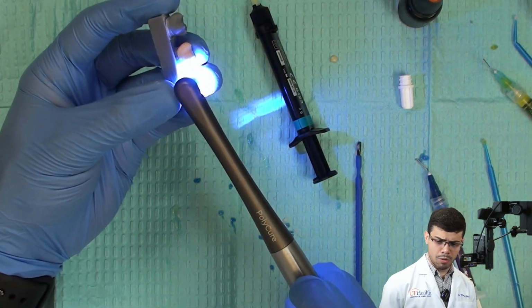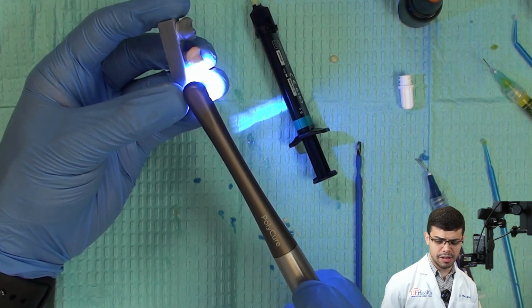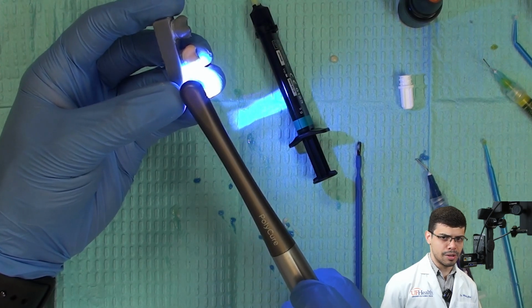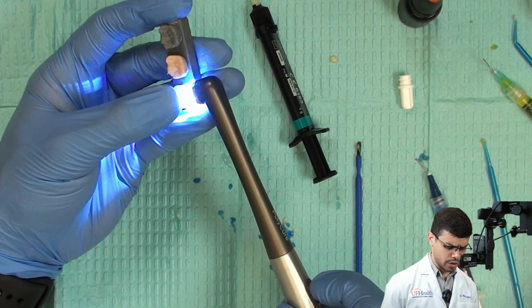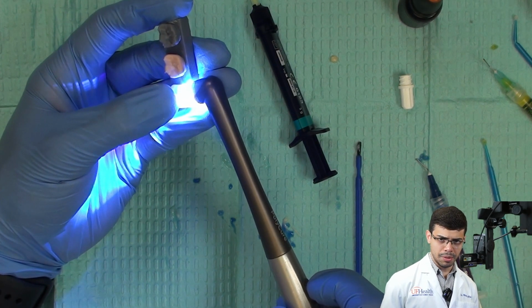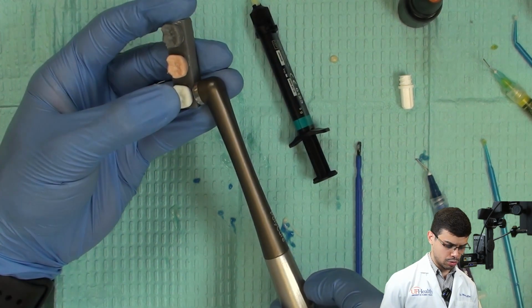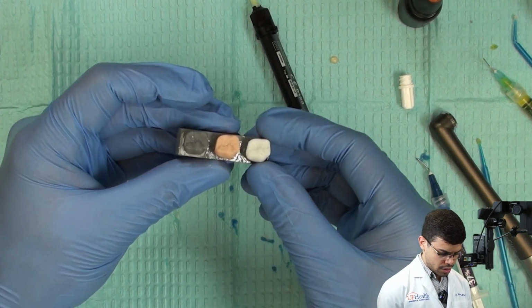And you might be asking, Dr. Rocha, why 20 seconds? Well, I previously calculated that. So you need to go ahead and think about what is the power that you have on your Valo cordless light or corded light, and what is the thickness of your ceramic. I'll tell you that the ceramic has about 3 millimeters, so you have to think about for how long you should cure these materials, okay? So once everything's set, you're ready to go.